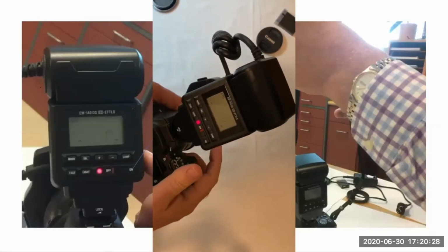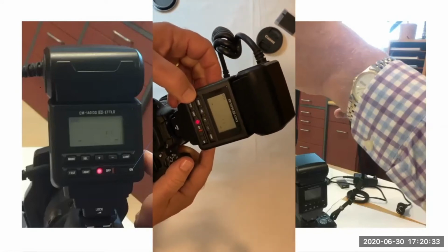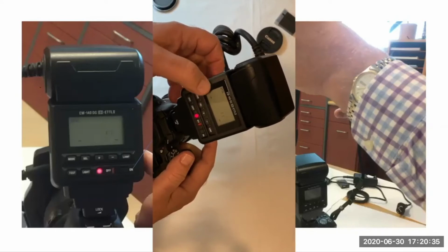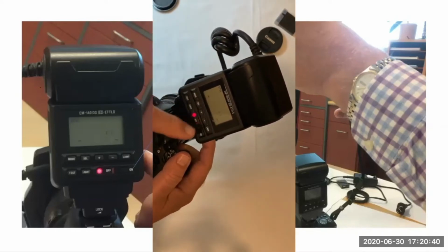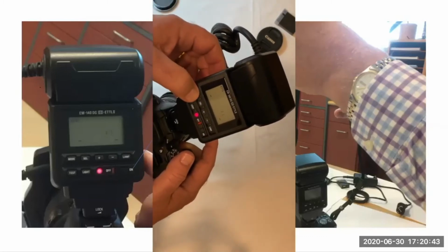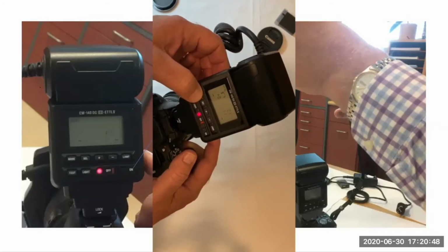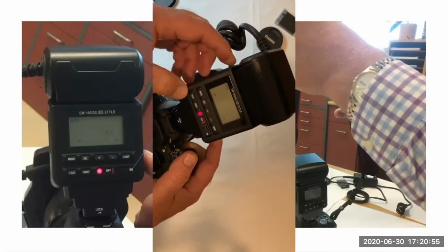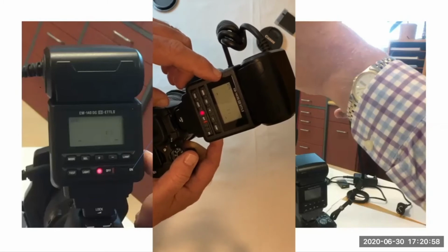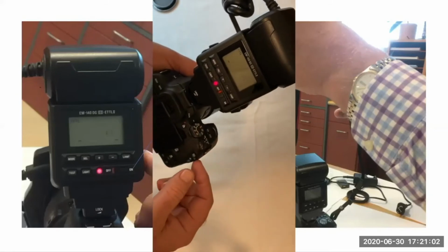There's a lot of different options that you can have the ring flash set on, and you can change that by changing the mode. And you can see at the moment it's ETTL, which is electronic through the lens, and a ratio of 1:1 left and right sides. You can change that to all sorts of different things that can get pretty complicated, telling it what type of camera you have or the way you want to photograph it. Just leave it on the ETTL, the electronic through the lens, and the camera and flash will sort it out.